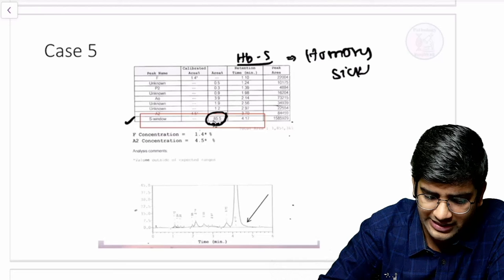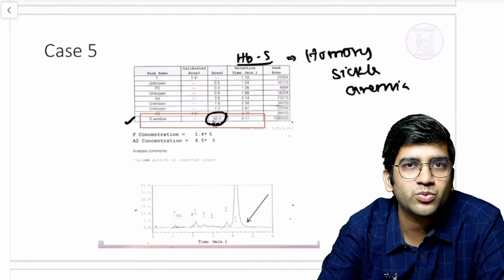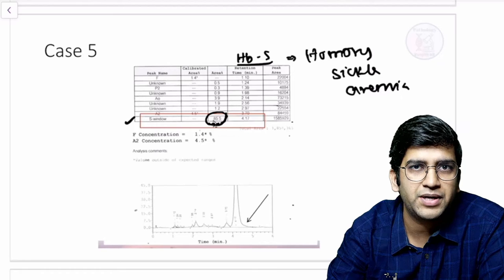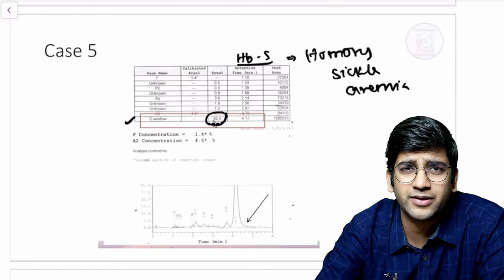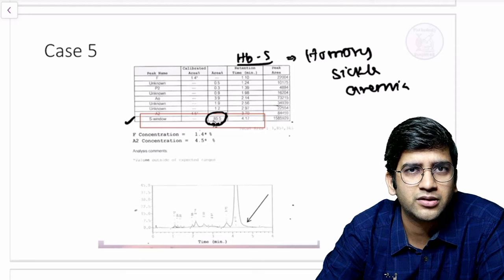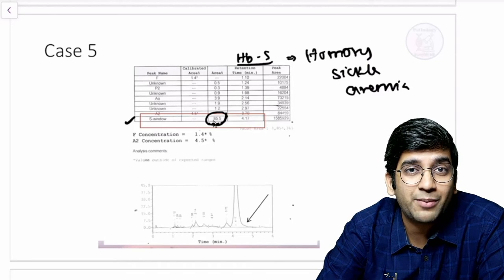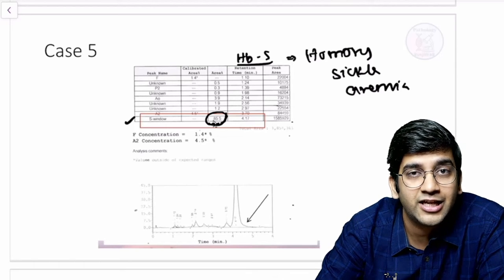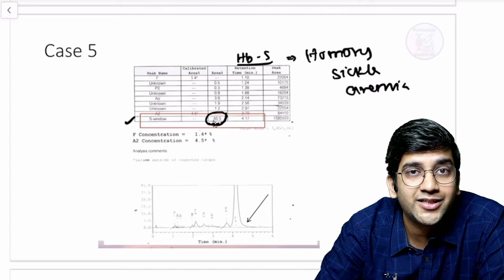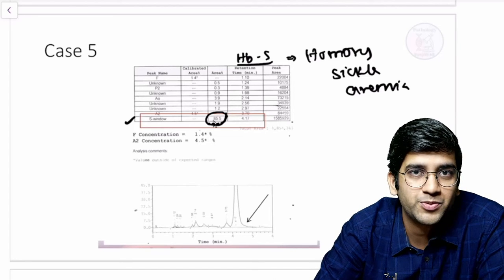I'll tell where we landed up in trouble. So what we had was, we looked at the patient. Patient was asymptomatic. Patient had a hemoglobin of 10.9 or something. No vaso-occlusive crisis, nothing. Sickling test was done. Sickling didn't happen. For a homozygous sickle cell anemia, sickling should happen immediately, right? Even after doing sickling test, the RBCs didn't sickle. But I'm having HbS of so high.